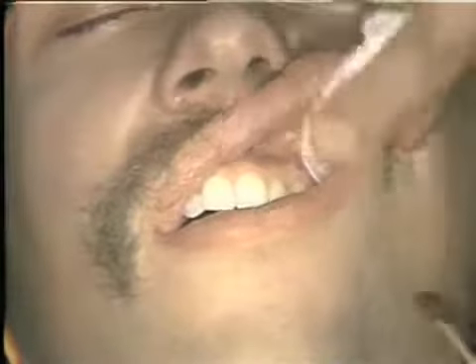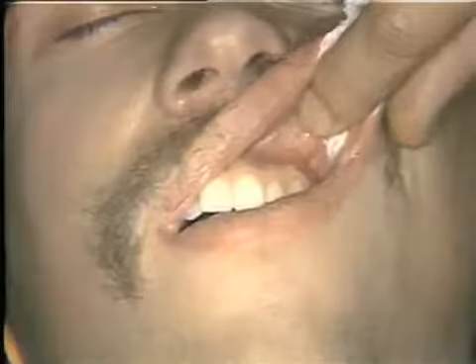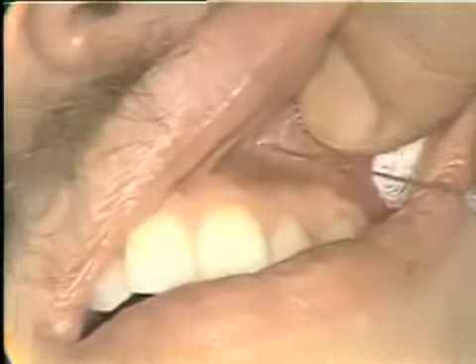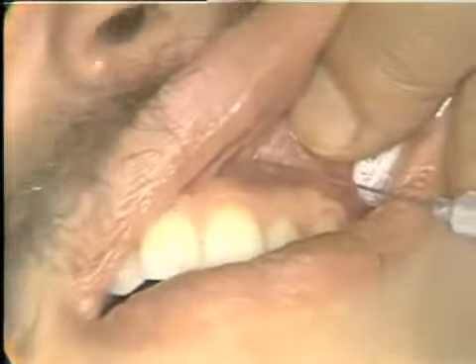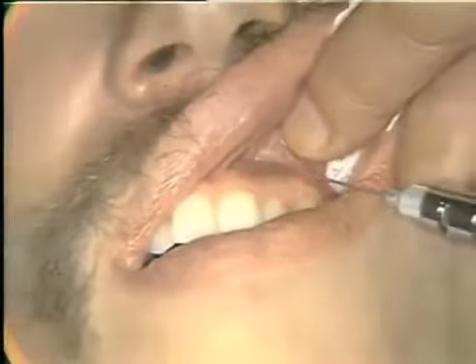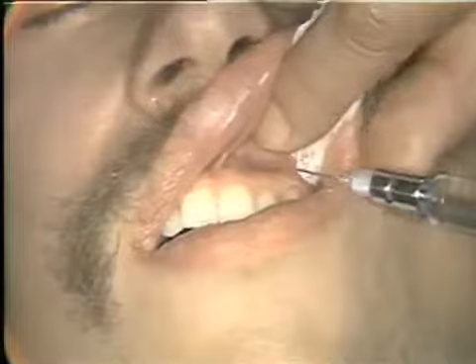Same technique, tissues dry, tincture betadine, through the vestibular tissues against bone and aspiration, and again injection of 1.5 cc of solution will very adequately anesthetize either the lateral or the central incisor tooth.